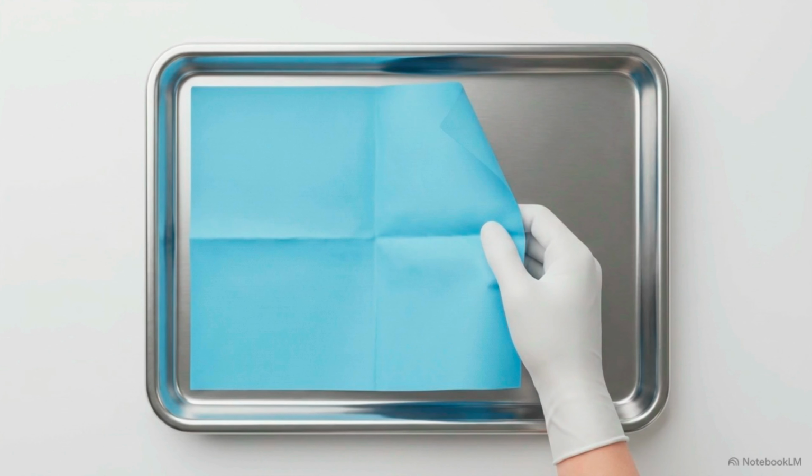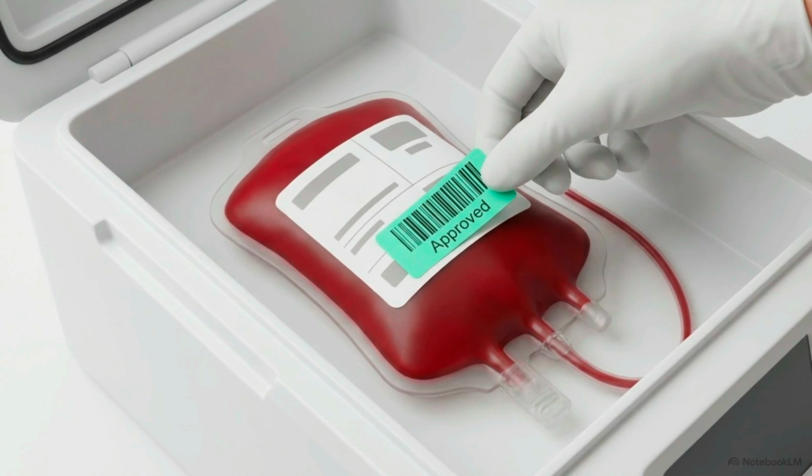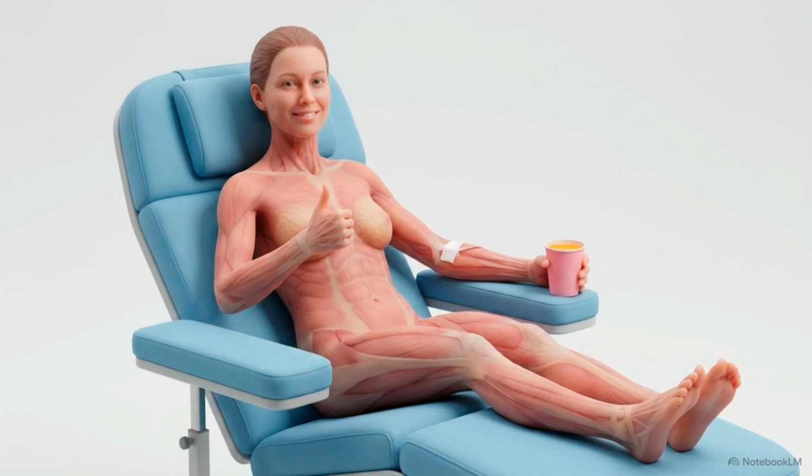We now proceed to the blood collection procedure. Proper laboratory practice and strict biosafety are paramount in this step. Proper hand hygiene is performed before and after donor contact. Once the donor is cleared, you need to stage your workstation. Ensure you have the primary blood bag containing CPDA1 anticoagulant and the necessary pilot tubes ready for immediate access. Following this exact sequence guarantees you will produce a cross-match ready blood unit for the laboratory while keeping the donor comfortable, safe, and willing to volunteer again.